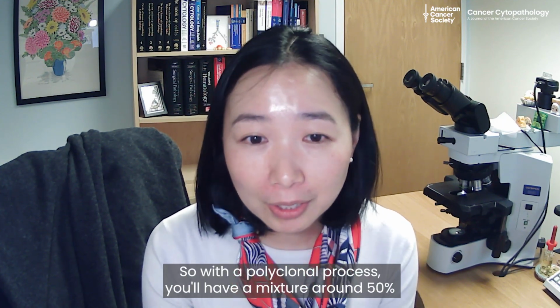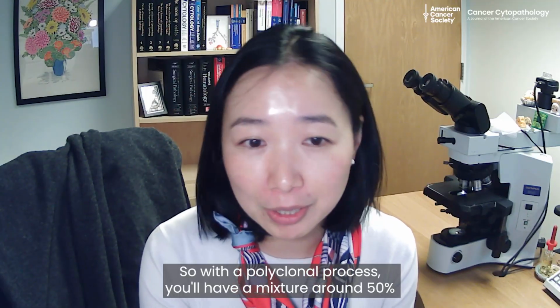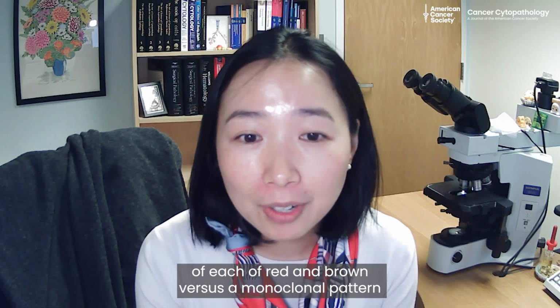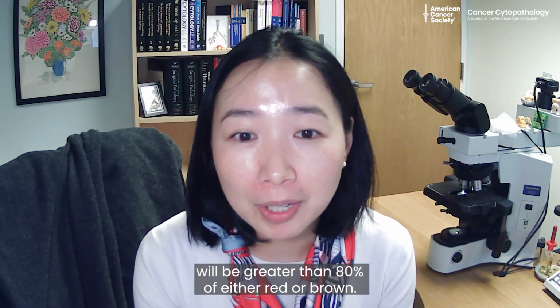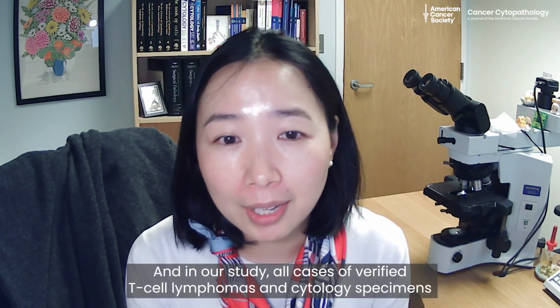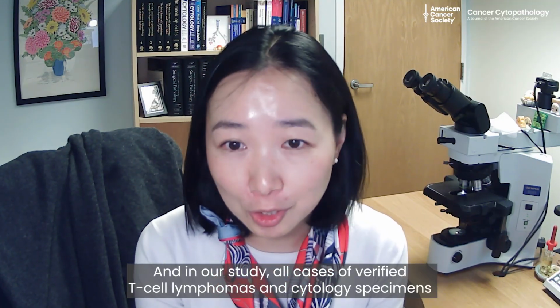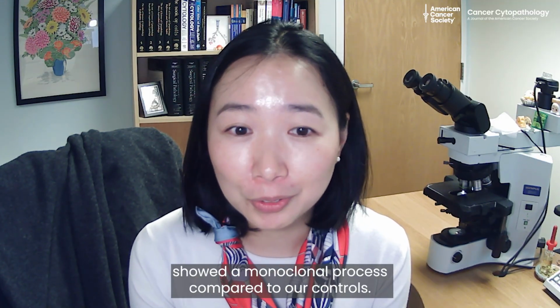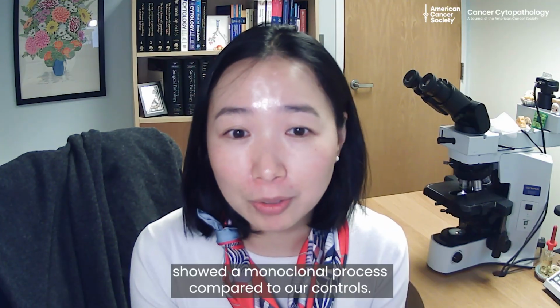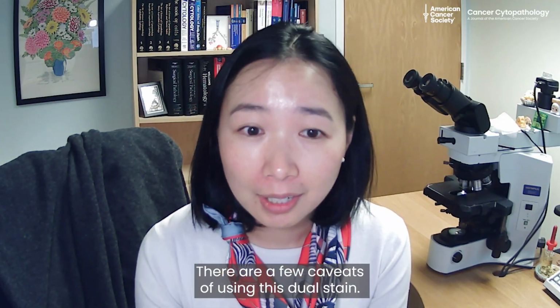So with a polyclonal process, you'll have a mixture around 50% of each of red and brown, versus a monoclonal pattern will be greater than 80% of either red or brown. And in our study, all cases of verified T-cell lymphomas in cytology specimens showed a monoclonal process compared to our controls. There are a few caveats of using this dual stain.